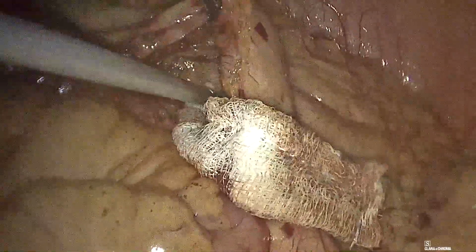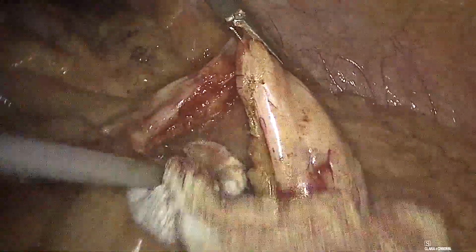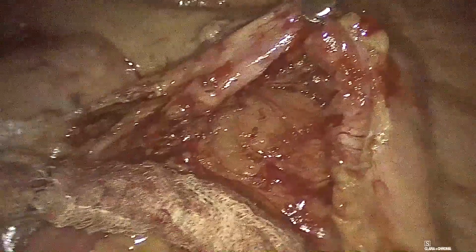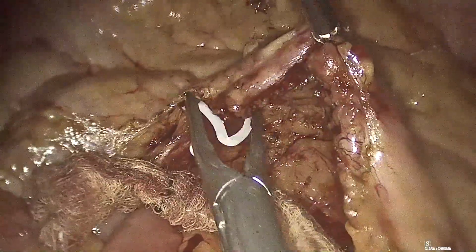Swabs were repeatedly used to control hemostasis and for blunt dissection, and also to identify the dissection plane. IMV was then clipped and cut to gain space for dissection and also facilitate tension-free anastomosis in the end.